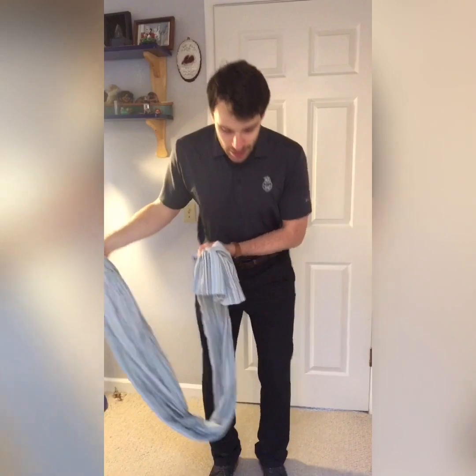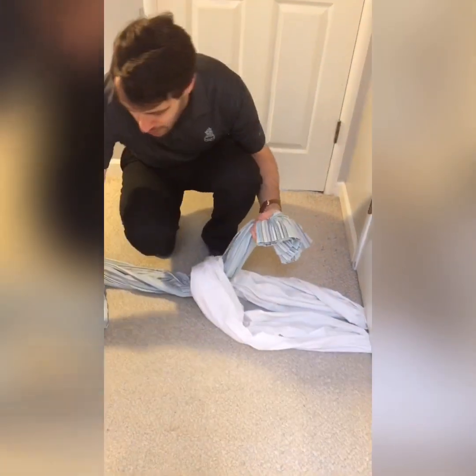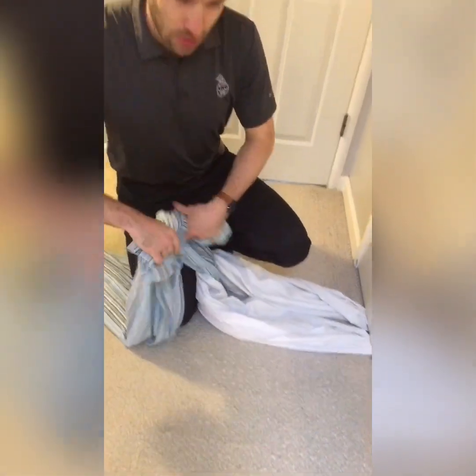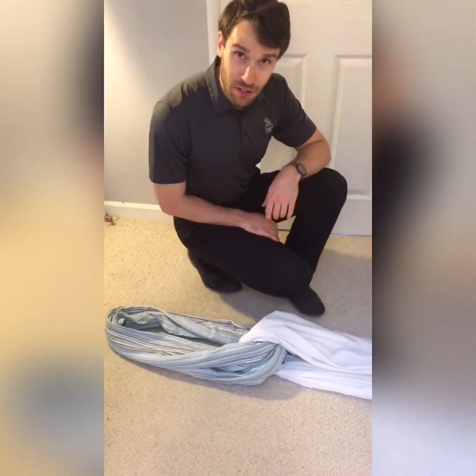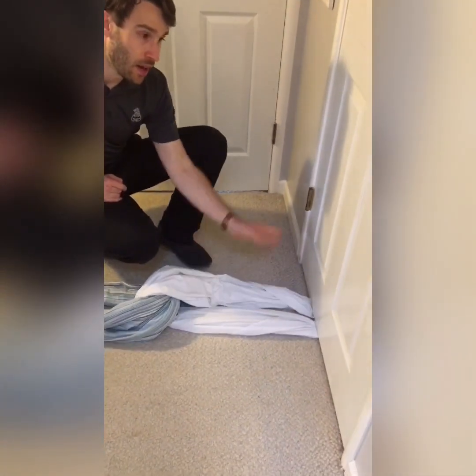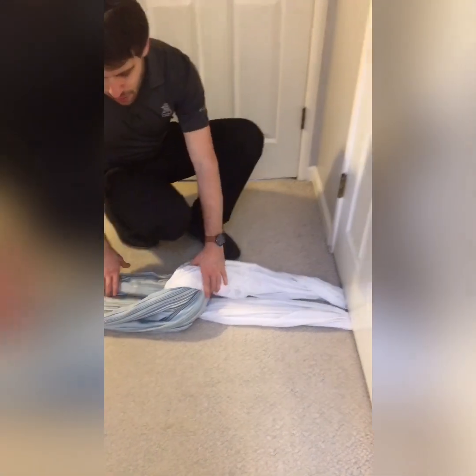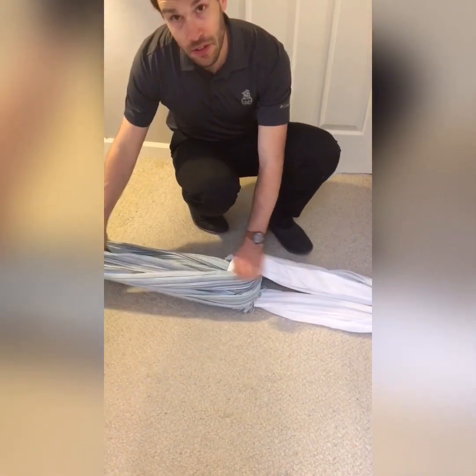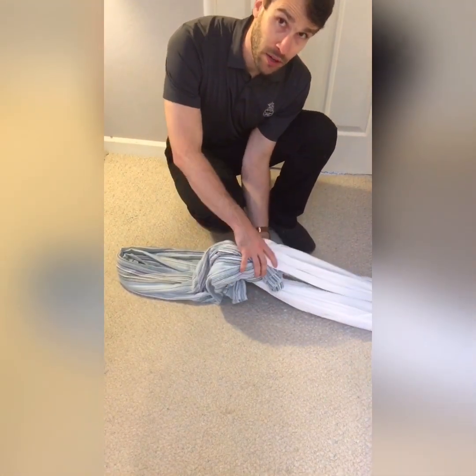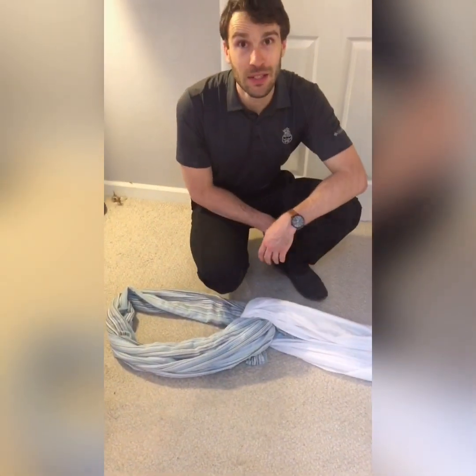Next thing I'm going to do is grab my next bed sheet. What you're going to do with that is loop it into the already looped bed sheet that you created and just tie it off into a knot, similarly to how you did the first one. What we have here is the final product. You should have one bed sheet that's tied, and on the other side of the door, the knot should be there attached. With your second bed sheet, you should have it tied into a loop with the knot around the area where your first bed sheet was. So now we're ready to do some lumbar traction.